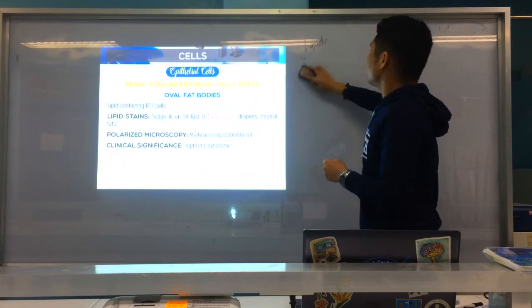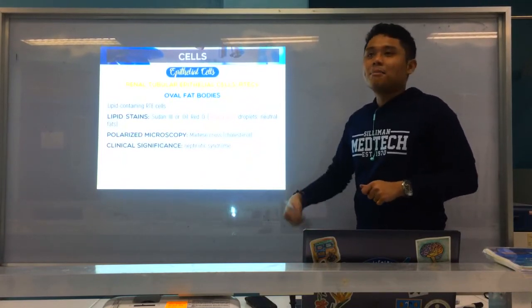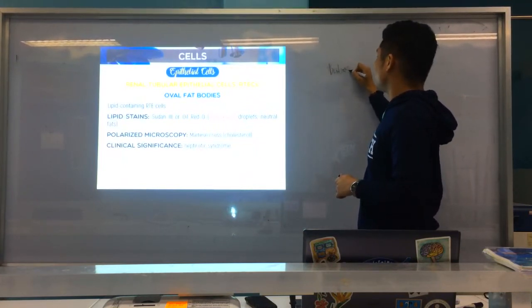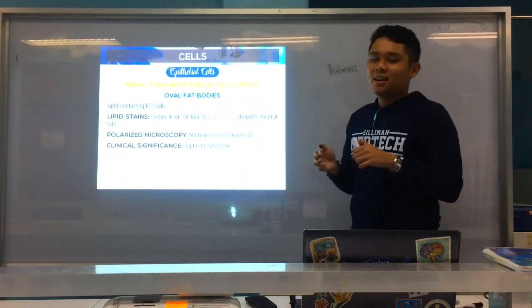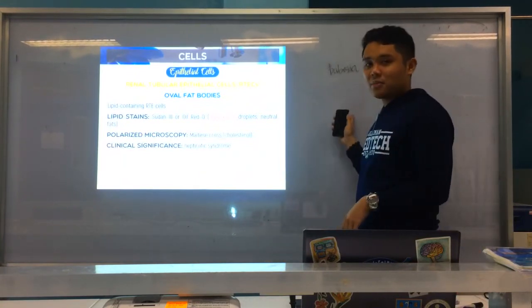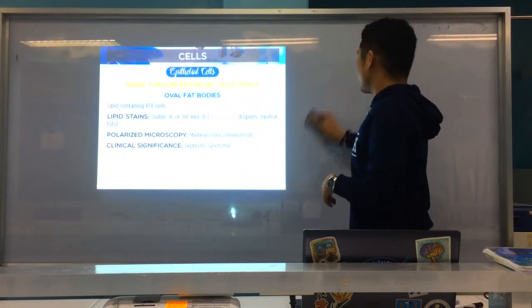Before we proceed, what is a Maltese cross? Maltese cross is also found in parasitology. Do you still remember? It is the Maltese cross formation of the apicomplexan, your Babesia. Babesia species. Whenever you see a Maltese cross in a parasitology case study, it is usually Babesia. Who is the vector of Babesia? Ixodes ticks. Okay.